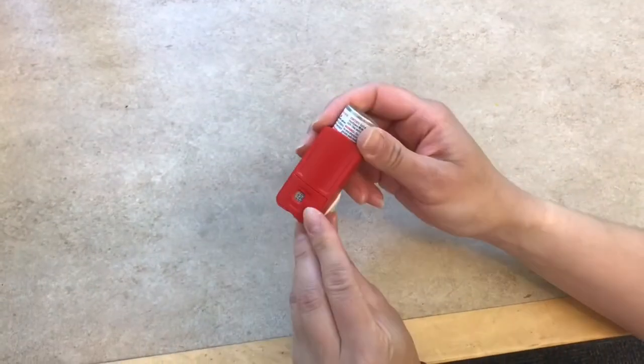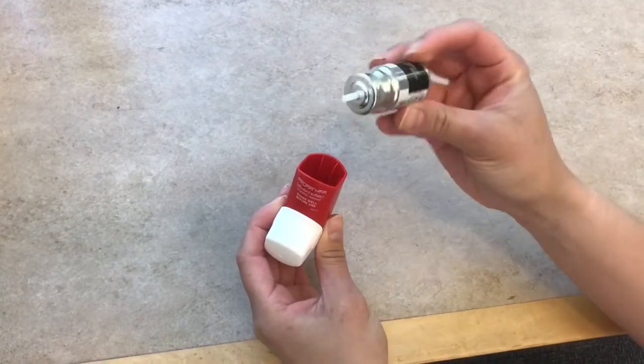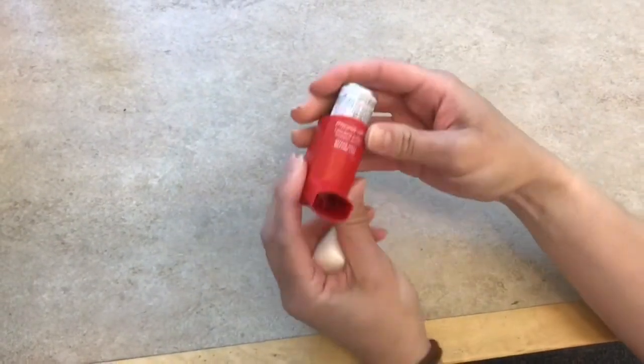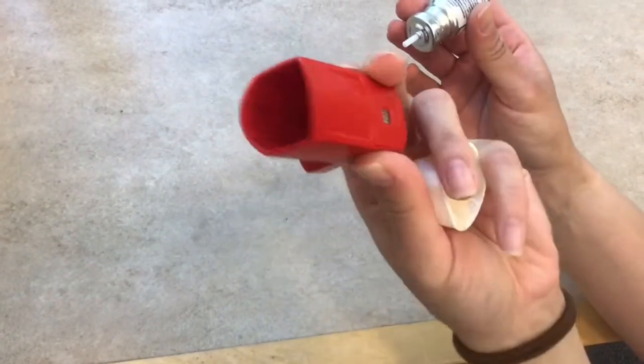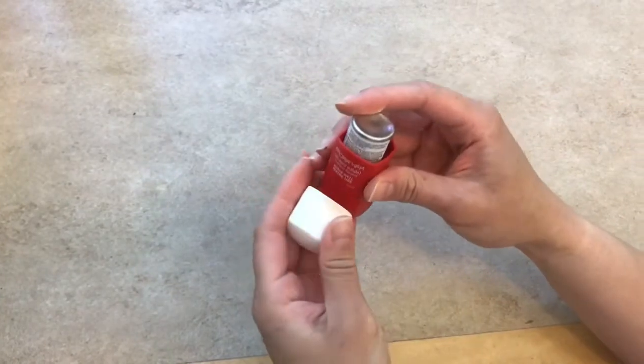How to use an inhaler. Okay, this right here shows you how many puffs are left in it. This top part pops off like that, and that dispenses your medication, and then this front part pops off like this, like so, and that is your little chamber that helps deliver the medication. All right.